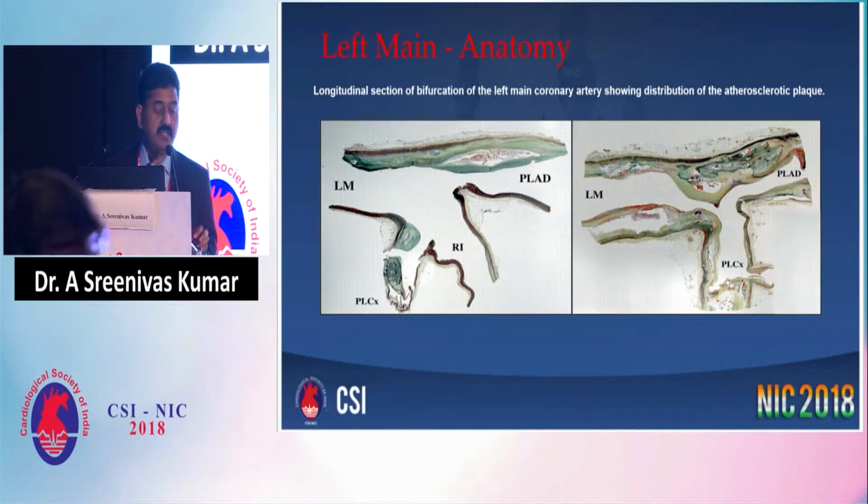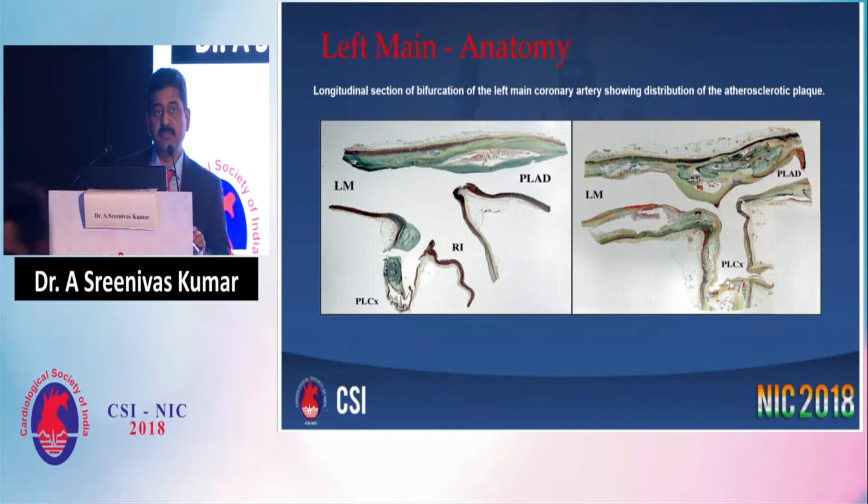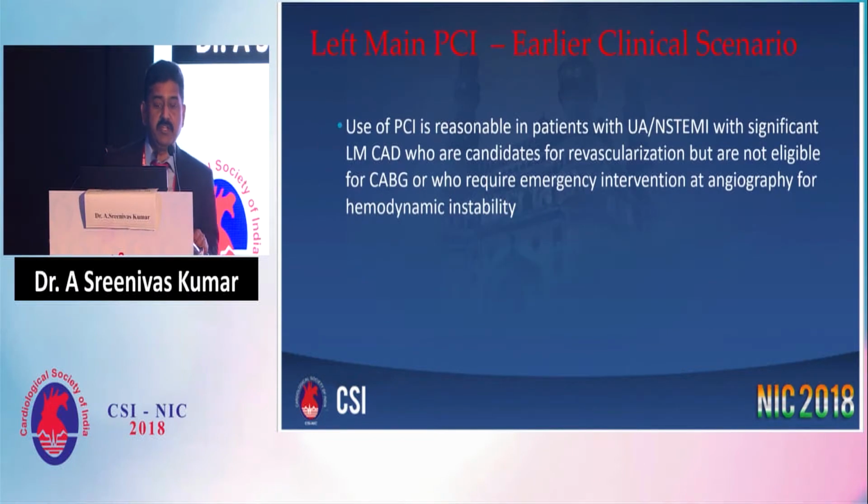Coming back to our topic, left main, this slide you must have seen in many places. Left main is not one single entity, be it shaft, ostium or bifurcation, and whenever it involves a bifurcation, that's where there are a little more problems. We have traveled a long distance from doing procedures as emergency bailout. Now we offer this as elective therapy. Yesterday I heard Ramesh and others say that shaft and ostium probably need not have a heart team approach. Bifurcation is one where it needs discussion. But because in India it's still our duty to keep the surgeon part of all discussions, it's better.